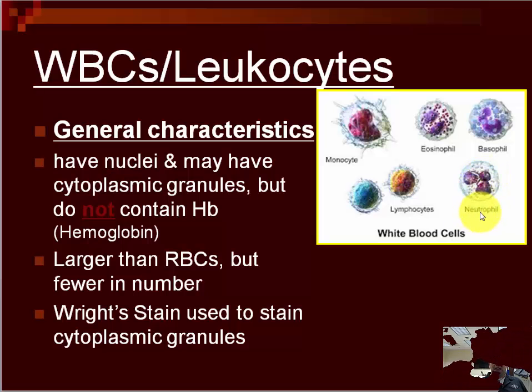Neutrophils stain a pale lavender color. Basophils are called basophils because they take up a blue dye. The eosinophil white blood cell takes up the red dye. So you have one cell that becomes more reddish, one that becomes more bluish black, and one that is pale, so pale that you can easily see its nucleus. These three are collectively known as the granular leukocytes.